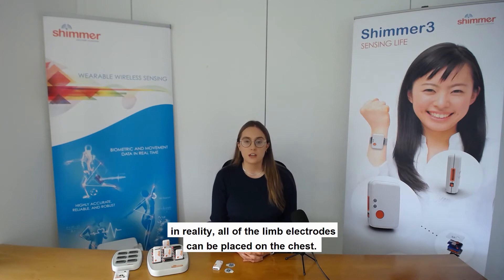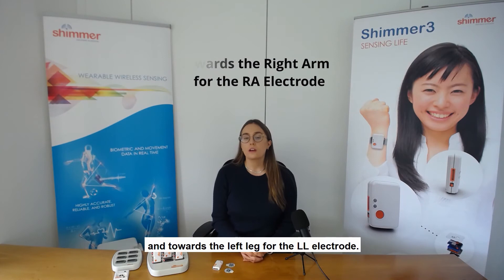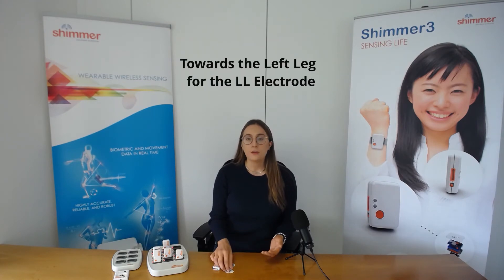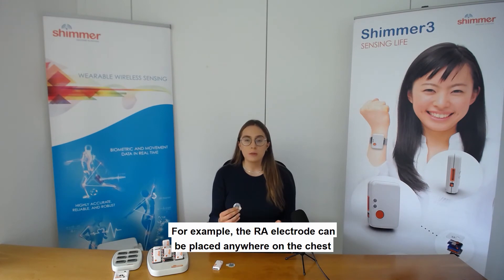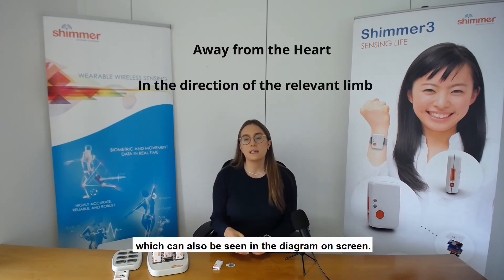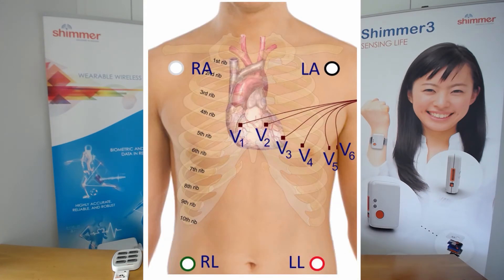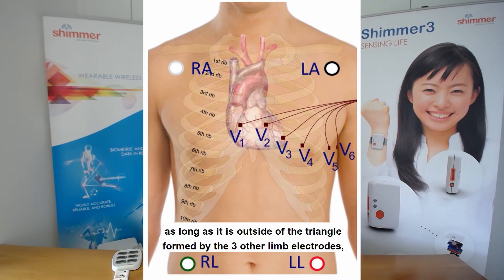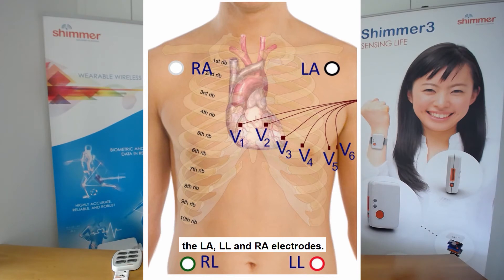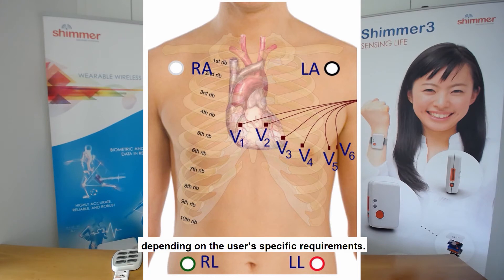Each electrode should be placed on the body, away from the heart, and in the direction of the joint to the relevant limb. Although it is common practice to place the limb electrodes on the arms or legs, in reality all of the limb electrodes can be placed on the chest. Generally, placement will be towards the left arm for the LA electrode, towards the right arm for the RA electrode, and towards the left leg for the LL electrode. The RA electrode can be placed anywhere on the chest as long as it is positioned away from the heart and in the direction of the right shoulder. The reference electrode, the RL electrode, can be placed anywhere on the body as long as it is outside of the triangle formed by the LA, LL, and RA electrodes. The VX electrode can be placed at any of the positions shown in the diagram, depending on the user's specific requirements.